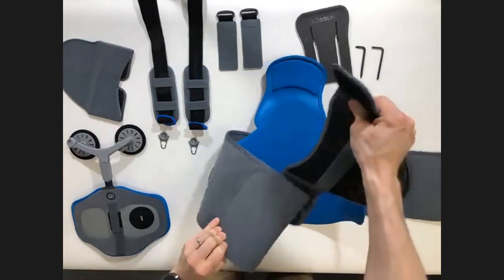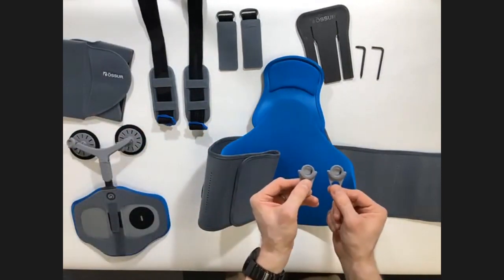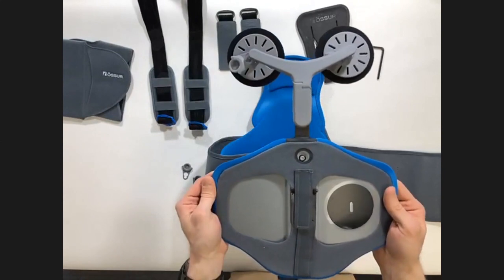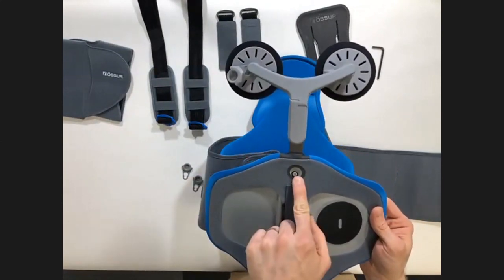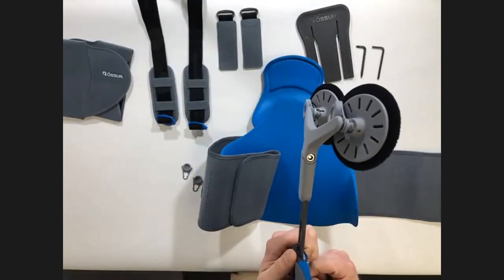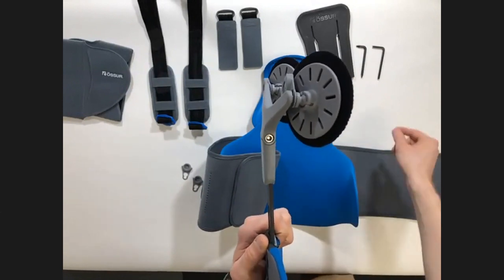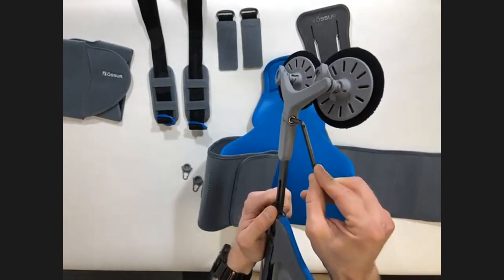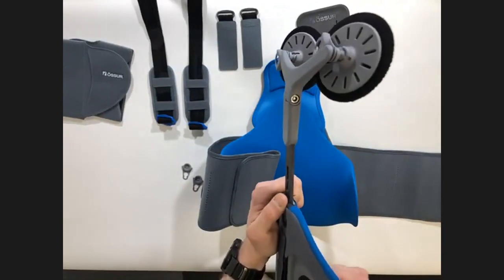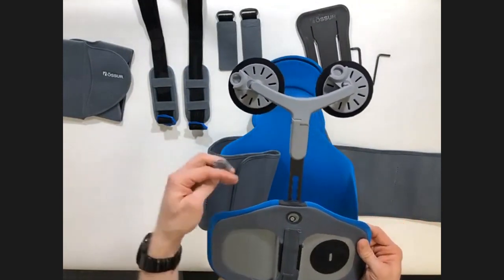Now for the third configuration of the system, you do need to add these extra clips onto the anterior thoracic extension. So I'm quickly going to show you how you do this and also highlight the height adjustability of this. There's a push button system here, and we can adjust the height. We can also add an extra link in here if we need to. I'll show you once we go over to Pete, but we can increase the height of this even further and add an extra configuration. There is also an Allen key, which means we can adjust this, and we can change the angle of this section here according to the patient's anatomy. So that locks and stays into position. So I'm just going to add these extra sections onto here.